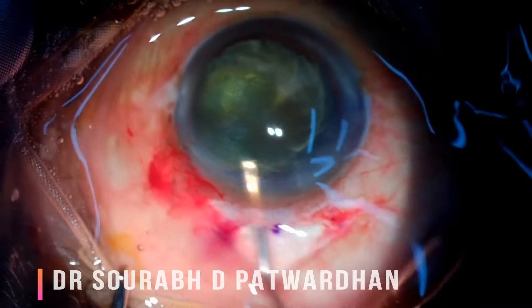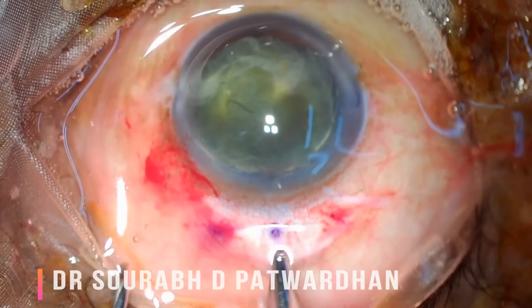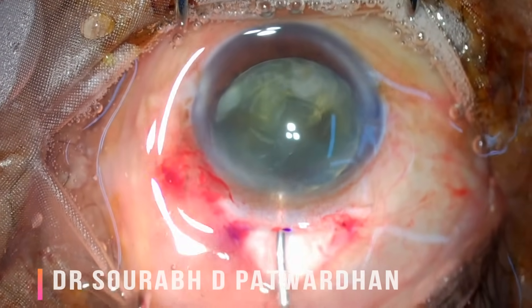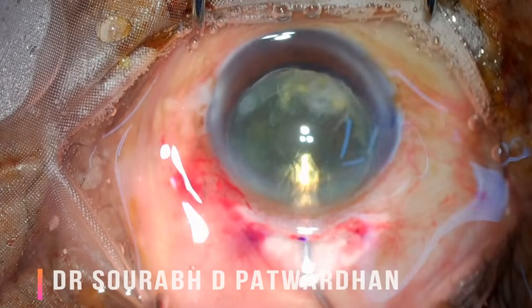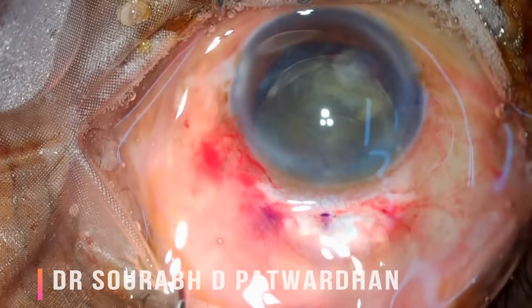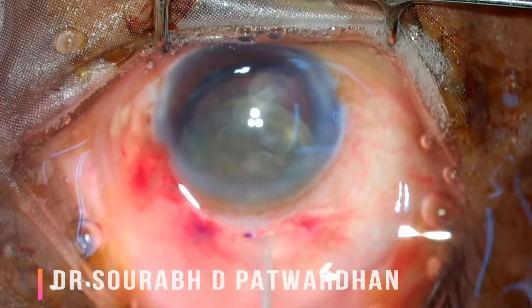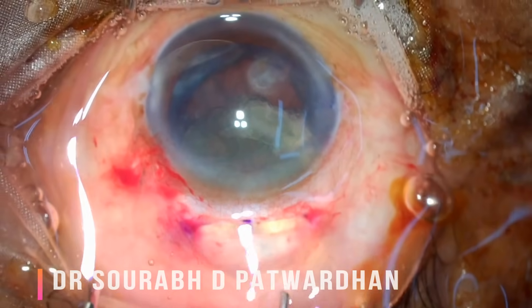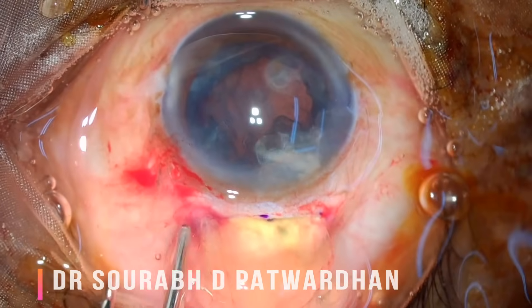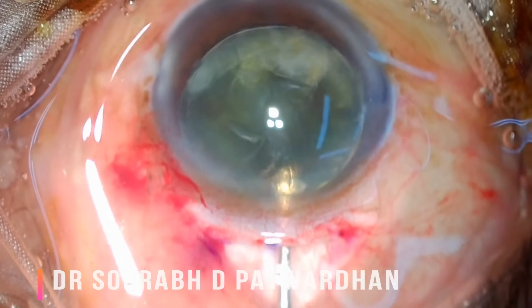Once the nucleus is out, you can just rotate it with the visco cannula itself, keeping some viscoelastic over and under the nucleus. This is a very important part of SICS — this is where good technique is required to protect the endothelium. The nucleus gets engaged in the scleral tunnel, and then you press the posterior lip using the visco cannula. You can also use wire vectis; if your scleral tunnel is of adequate length and well configured, the nucleus comes out easily.